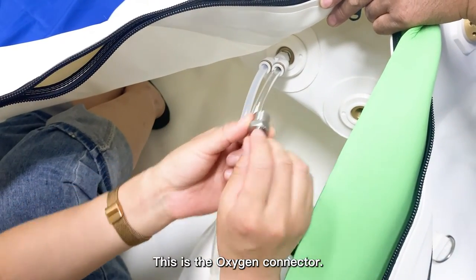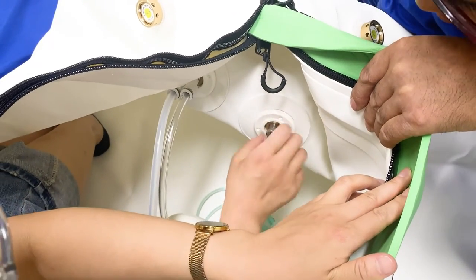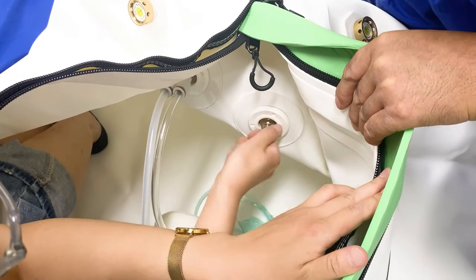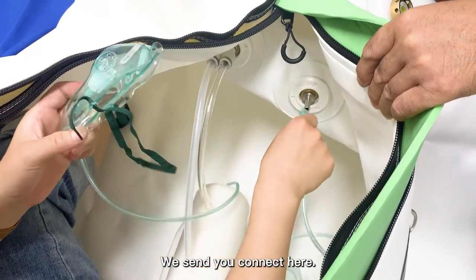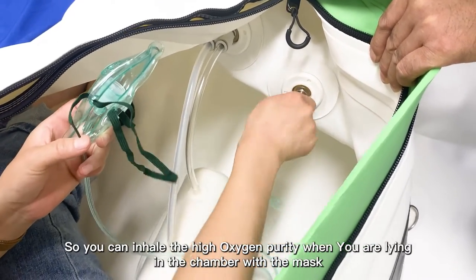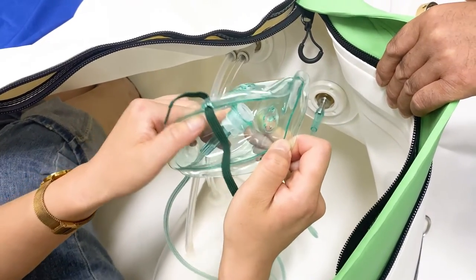This is the oxygen connector — connect it here and screw tight. Then with the mask we send you, connect it here. So you can inhale high oxygen purity while lying in the chamber with the mask.